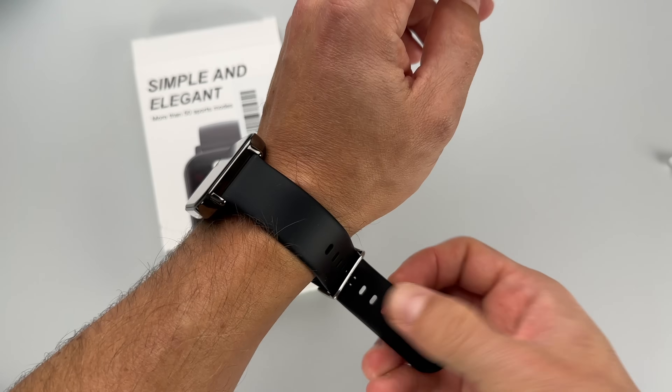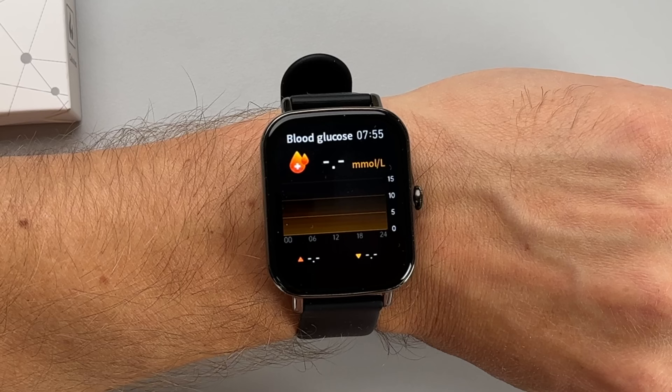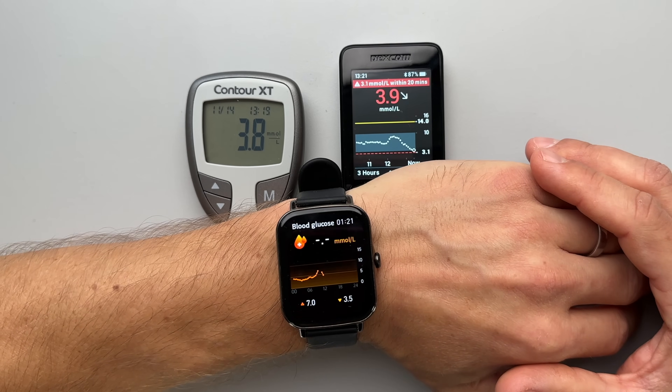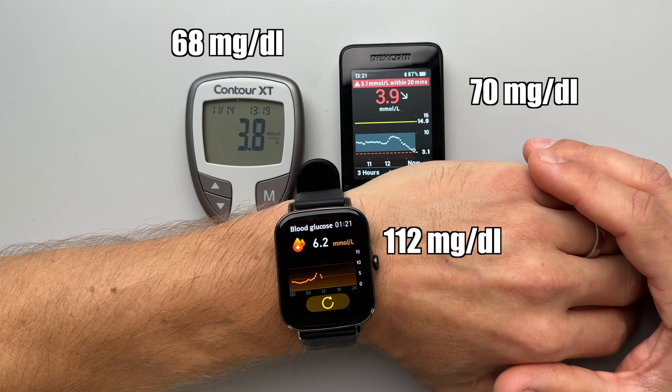About a year ago, I tested this cheap smartwatch that claimed to offer non-invasive glucose monitoring on your wrist. But when I compared the blood sugar reading to a finger prick, I quickly realized it was a scam. The non-invasive readings were completely off.